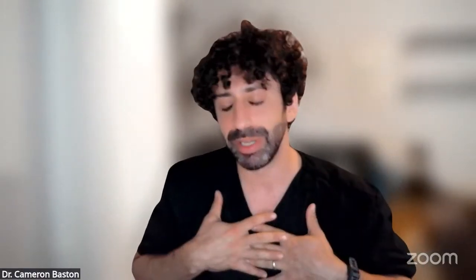I'm going to be extra aggressive with my diuresis before extubation, and I'm going to think about, is this the patient who I extubate to positive pressure, to BiPAP or CPAP, rather than extubating to high flow or nasal cannula. And so again, thinking about this not as one thing, but just giving us information about the overall alveolar interstitial space, and kind of letting that drive our decisions.